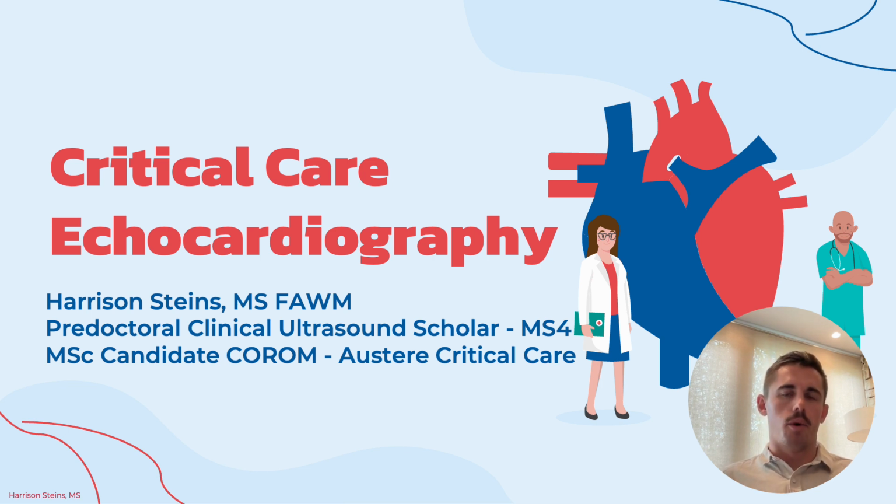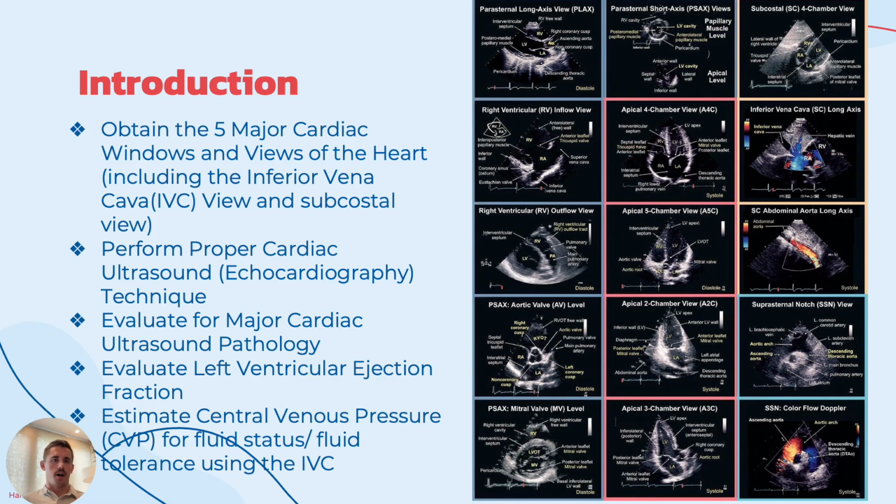So I went through the literature, I went through countless videos, spoke with many physicians, and looked through all the information out there and developed my own lecture on a condensed version of echocardiography for an emergency medicine critical care provider. And in an effort to expand my knowledge base, I wanted to record this lecture so I could help anyone else looking for the same. So what we're going to do today is go through an introduction into the five major cardiac windows and the views of the heart.